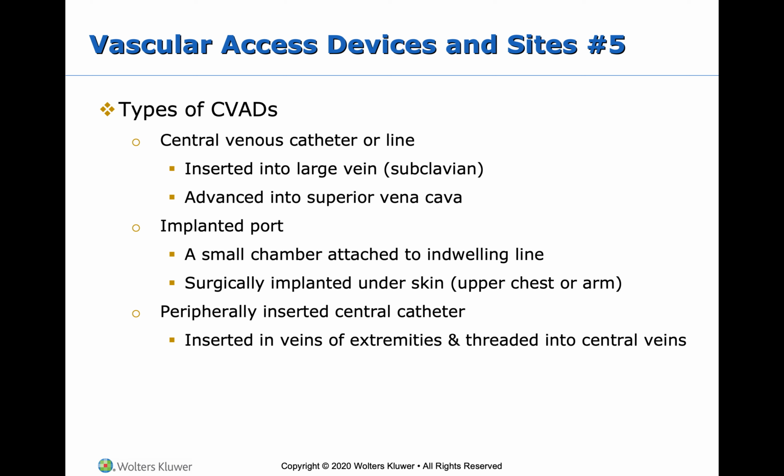And then once they draw that, how are we going to get it from the syringe into our correct tubes? We're going to follow the same order of draw, and you're going to use your little transfer device that just screws onto the end of the syringe. So remember when we were talking about our SPS tubes and how they can be used instead of blood culture bottles in certain situations, and how we have to transfer those into the blood culture bottles.